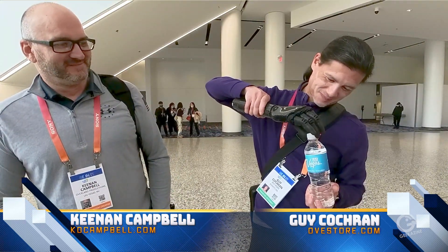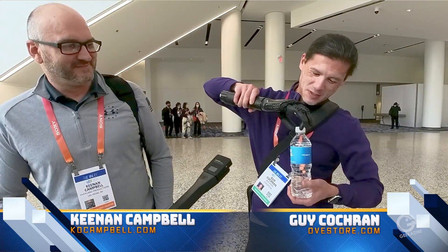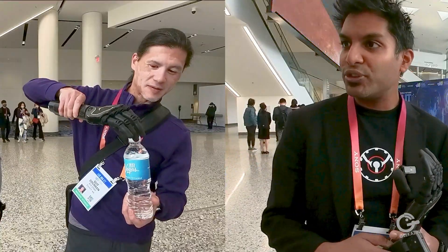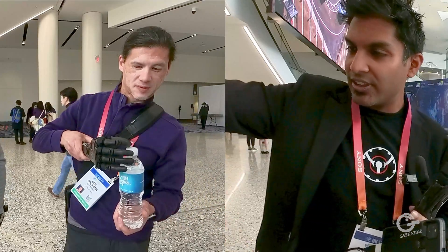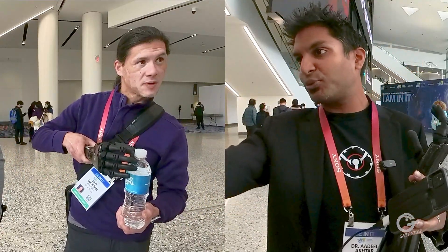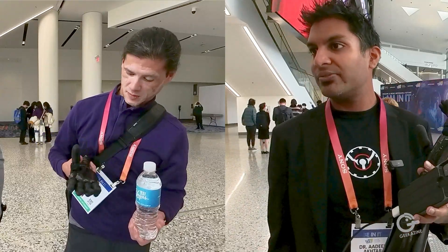Is it hard to control the pressure? Not at all. The guy's trying to take off a bottle cap — would I be able to apply enough pressure? You might be able to if you use a different grip, like with the thumb, grip it in there and wrench it around. You'd have to switch which grip you're on.